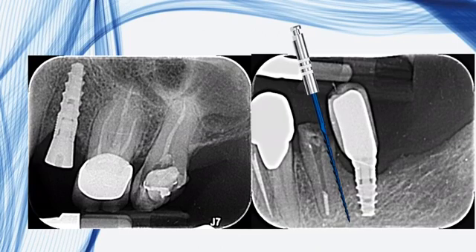Okay. What is your cleaning protocol, which flushing agents do you like to use the most? Okay, I'm gonna talk about this. I love sodium hypochlorite. That's for me the way to go from the beginning. I use sometimes EDTA while preparing narrow canals, but I'm going all the way, flushing, irrigating, flushing, cleaning, all the time with sodium hypochlorite. And at the end, I use PUI and I agitate the cone. Or sometimes I use laser, but not every time.